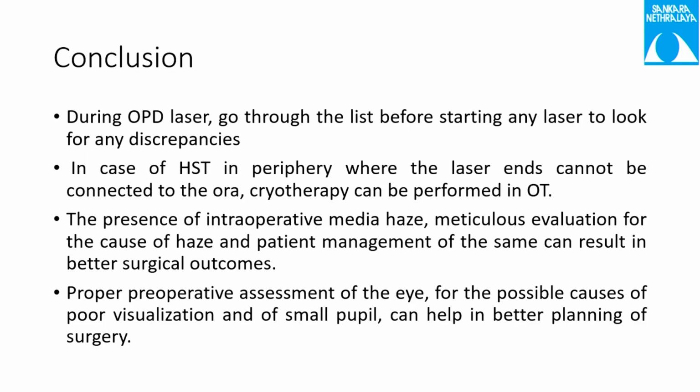In the presence of an intraoperative media haze, meticulous evaluation for the cause of haze and proper management of the same can result in better surgical outcomes. And proper preoperative assessment of the eye for possible causes of poor visualization and small pupil can help in better planning of the surgery.